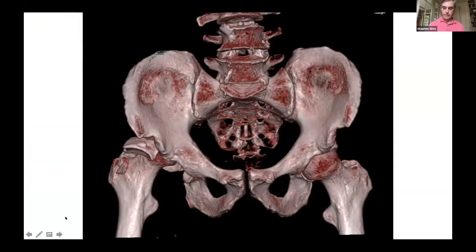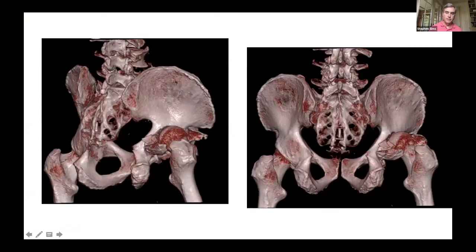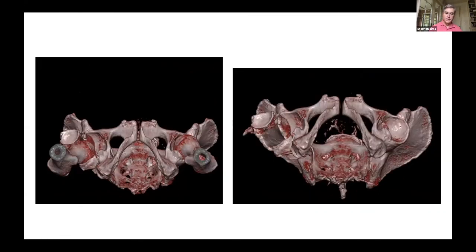Okay, so I'll show the 3D images for you as well. We've got multiple of those to look at, and then I think we can stop and have some brief discussion about ideas from there. Again, you can see the dome of the acetabulum flipped out here. Here is basically the entire dome of the acetabulum out here, far from where it should be. And again, this shows the amount of comminution of the remaining posterior wall of the acetabulum. Here is a cut looking at it from above, which I think shows it nicely. You can see the actual acetabulum here, and this is the big defect where it should be and where the head was sitting while we were waiting for surgery.